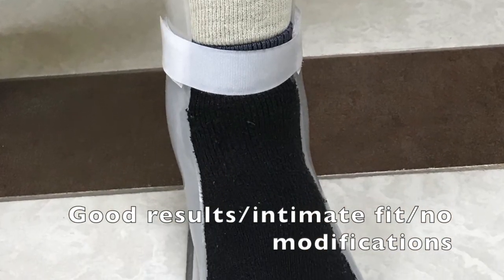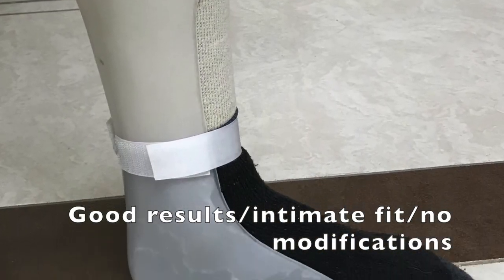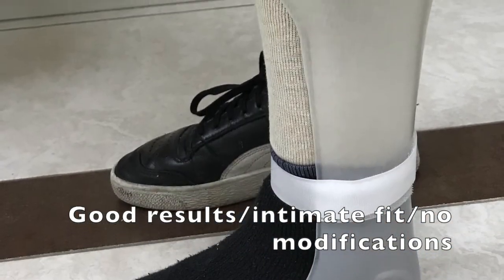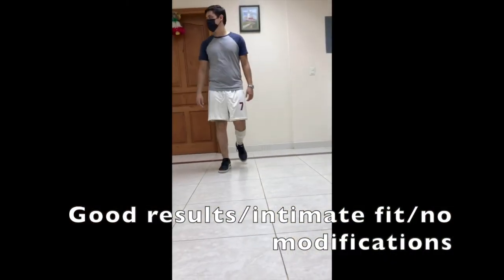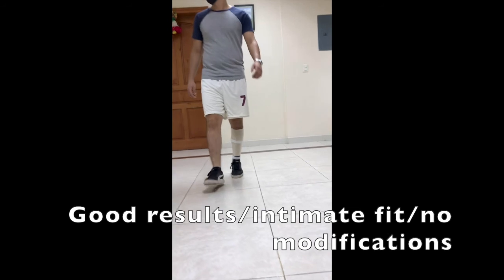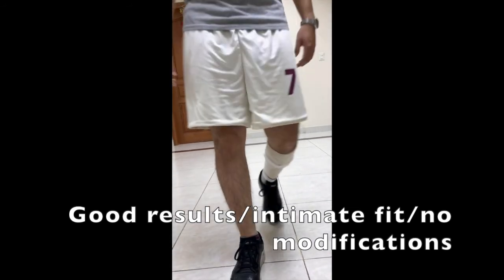Here you can see the results. In this example we just fit the patient without any extra modification, and you can see such an intimate fit. In the video you will see how nice and intimate the fit is. Muchas gracias.